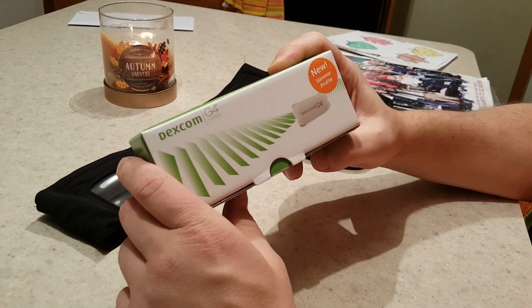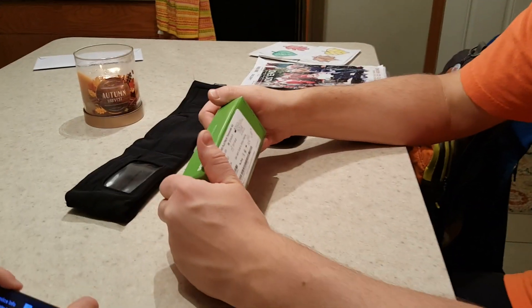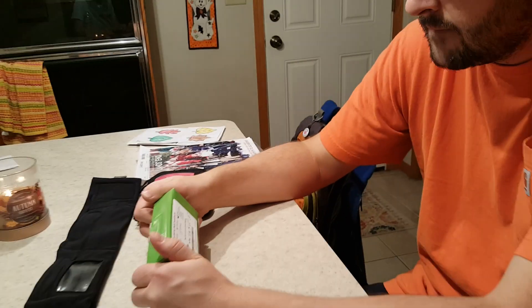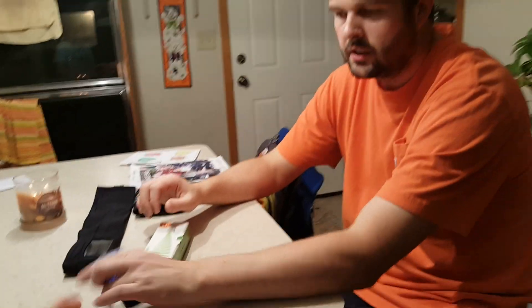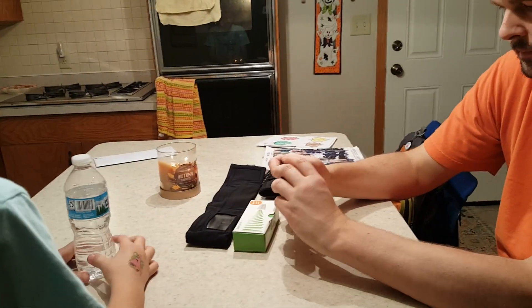We got a new transmitter. We had some problems earlier and they told us to get a new one. I wanted to do it before January. I don't know what the deal is with our insurance — it didn't cost us much because of our insurance. Yeah, I wanted to do it before January before it turned over.